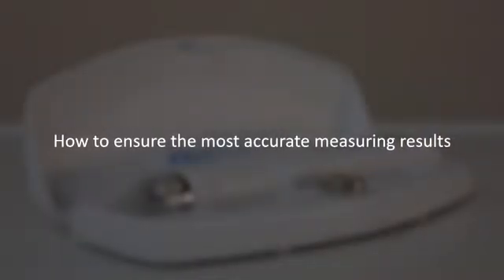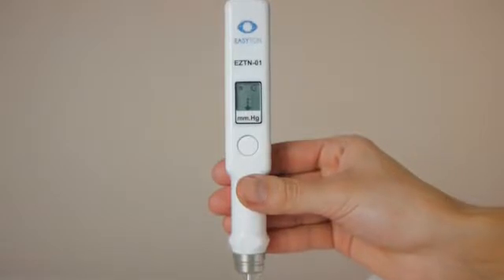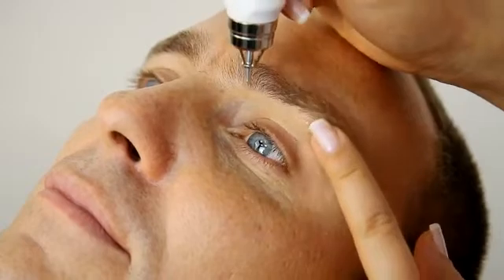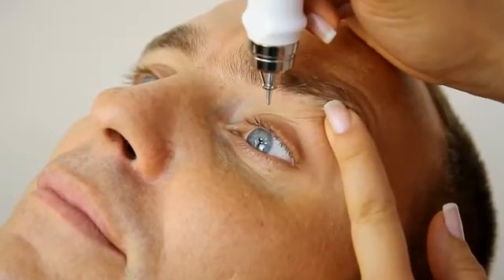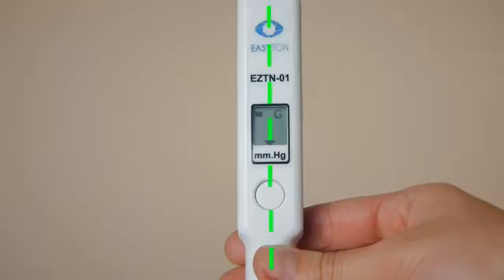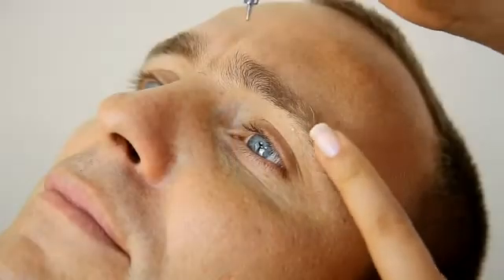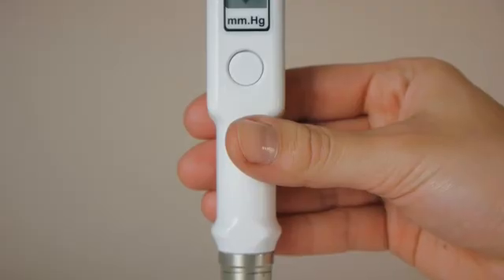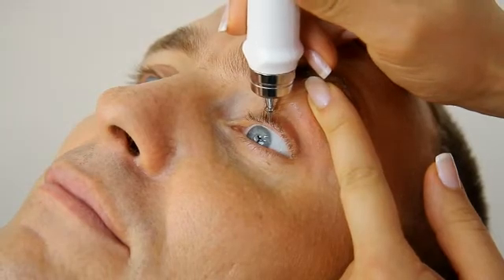How to ensure the most accurate measuring results. Follow these simple rules to achieve precise measurements. Ensure a proper grip and gliding movements of the tonometer. Provide support for the hand to make your own movements more precise. The patient's gaze must be fixed at the test object. Place the tonometer strictly upright. Stretch the eyelid smooth, avoiding any folds. Place the tonometer rod properly and make sure it doesn't shift along the eyelid surface.